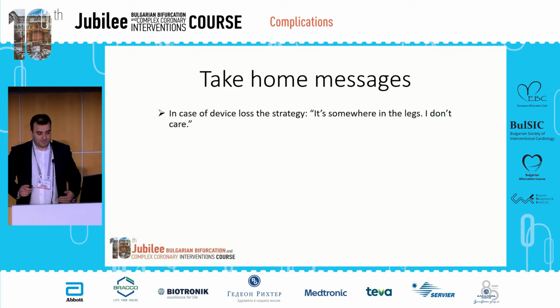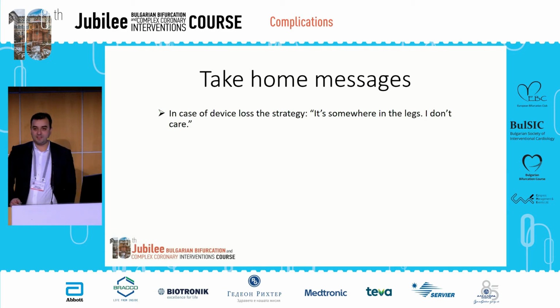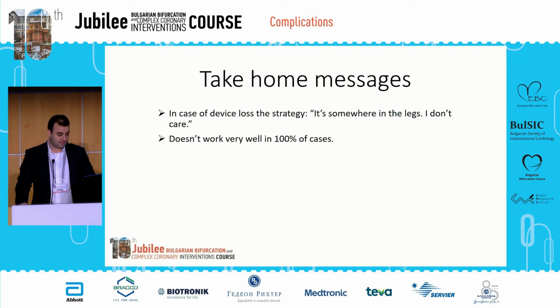A few take-home messages, maybe more for me, not for you. But in cases of device loss, it doesn't matter. It's a tip of a catheter or something where the strategy is somewhere in the legs. I don't care. It doesn't work so well in 100% of the cases.